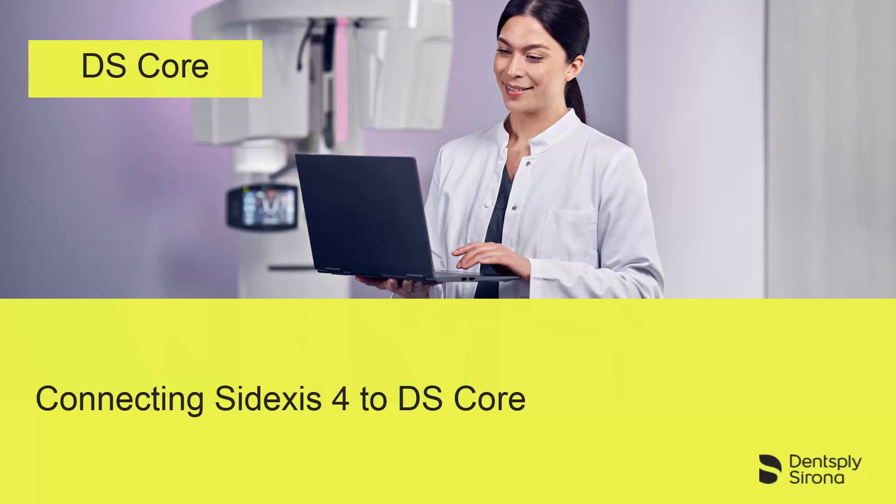Welcome to this video tutorial on the topic of DS Core. In this video, we will guide you through the process of connecting Sidexis 4 to DS Core.